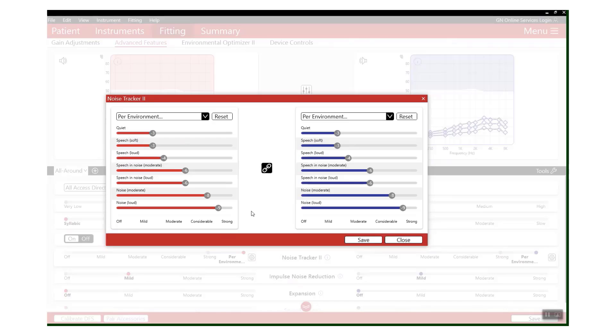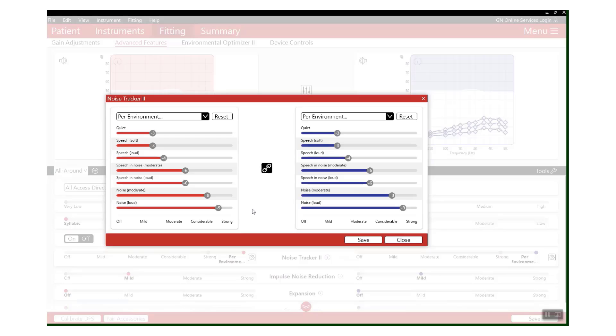So what this means is that it's going to allow you to manipulate the amount of noise reduction that you'd like to apply to any particular environment, up to a level of 10 dB.